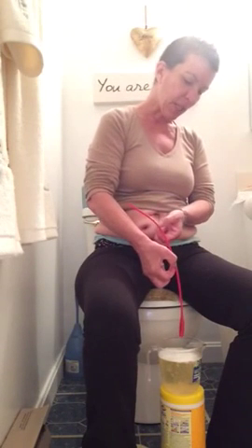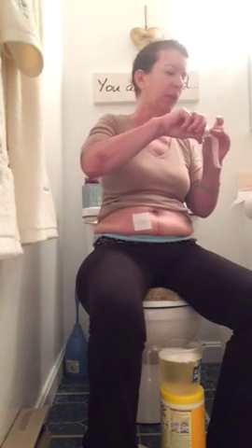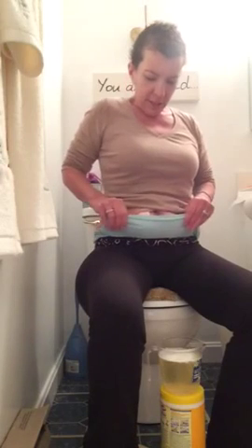So that's it. So now I'm going to take it out. And when I take it out, there's always something in the catheter, so I make sure I keep it over the cup. I'm going to wipe my stoma again, briefly. I put a little square piece of gauze on. Again, the gauze is sent to you. They don't usually send you enough, but you can buy it at any CVS store. This CVS brand is really nice and soft. There are brands that aren't woven so tightly, and they just seem a little scratchier. And that's it. And then you're ready.